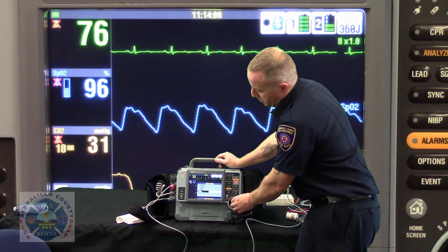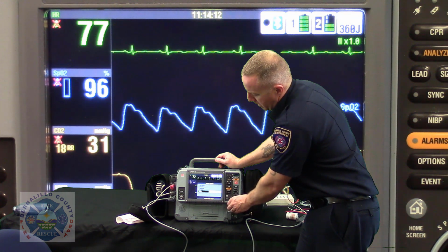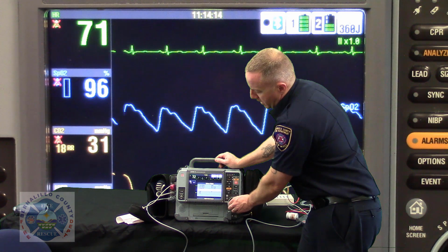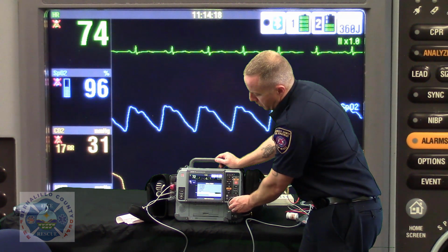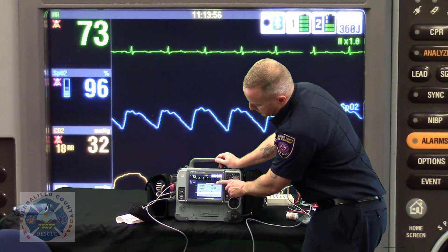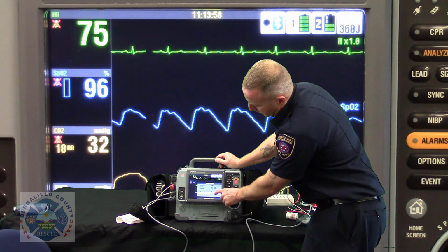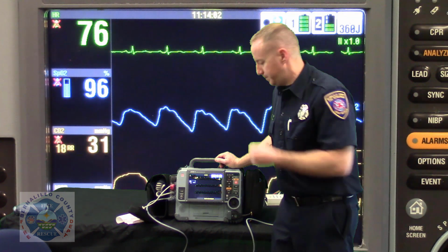Now we need to make sure that we do the correct age. Yep, it's 40, and I'm happy about it. And the gender. And so we're going to go gender. Double check here while the screen's still hot: King Matthew, birth date, age, and gender. We're good, and we're ready to go ahead and transmit.